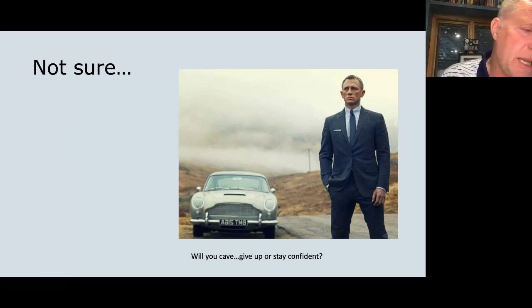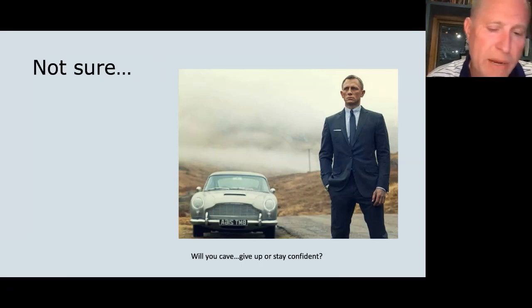What about those patients that say, I'm not quite sure? Well, one thing that you could do is, I have dozens and dozens of patients who've signed a waiver and have conveyed on video how these things have helped them. You can show them videos like that, that you've gotten approval to show. You have to have the patient sign a waiver validating that. I have those waivers that I've done.